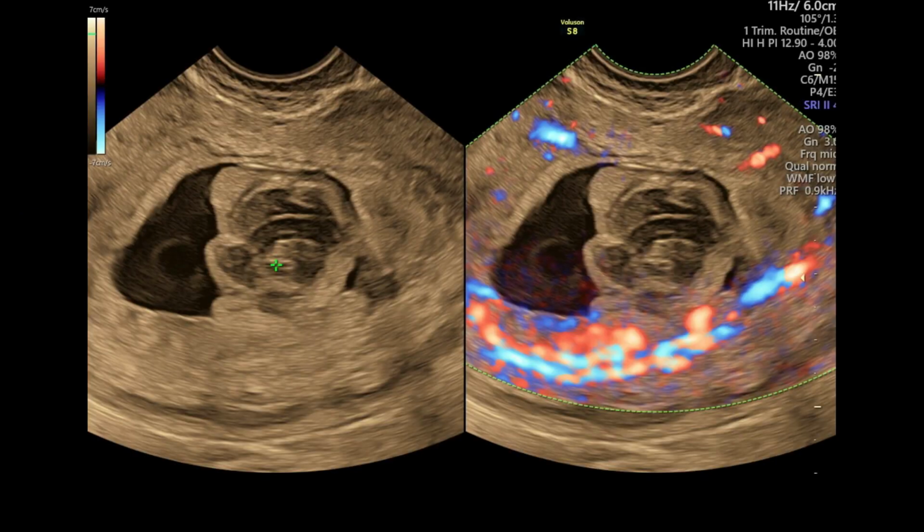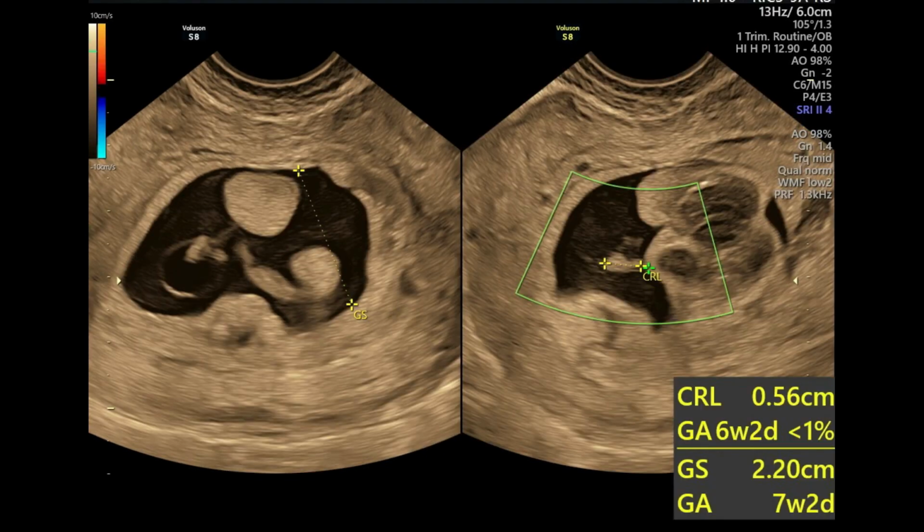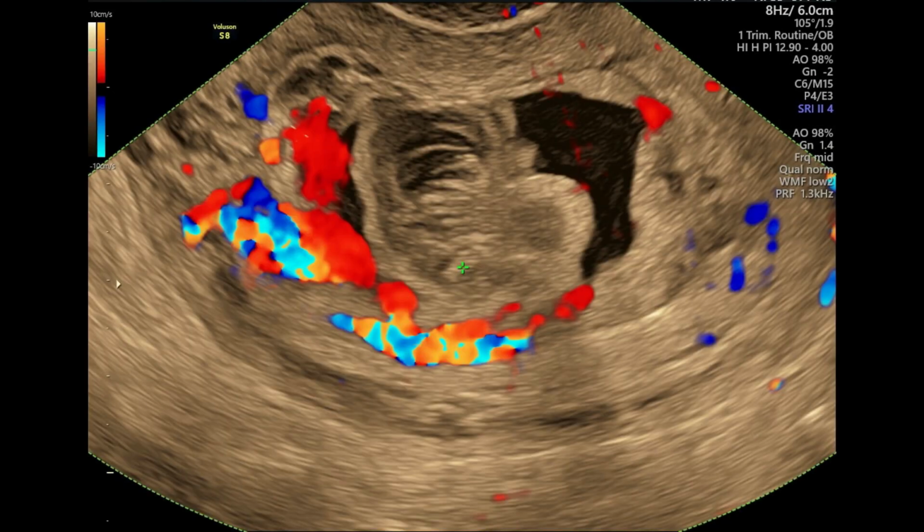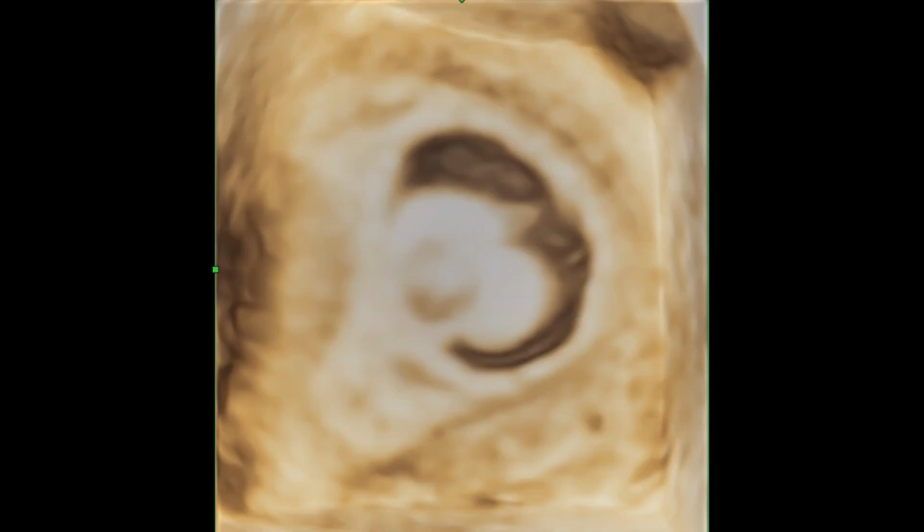Think about the findings. You can have some differential diagnosis and you can come to the final diagnosis with the two scans, the initial one at 6 weeks and the other one at 8 weeks. If you want more time, please pause the video and go back to assess again. I'm going to give the answer. Are you ready? Let's go.